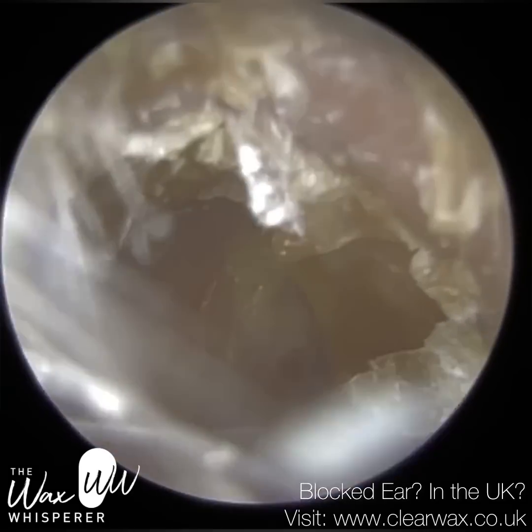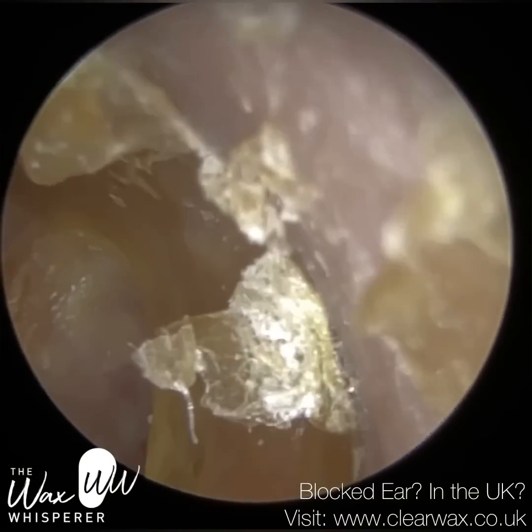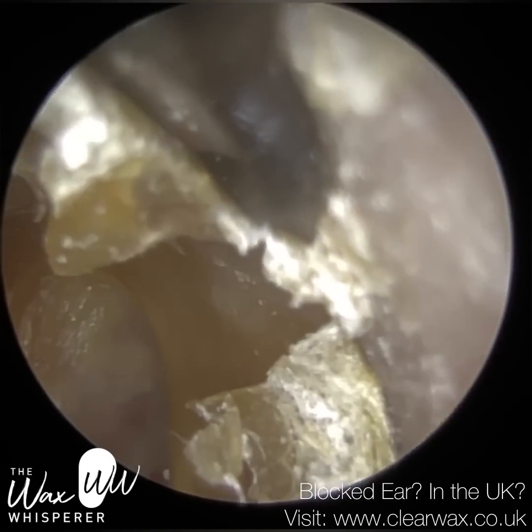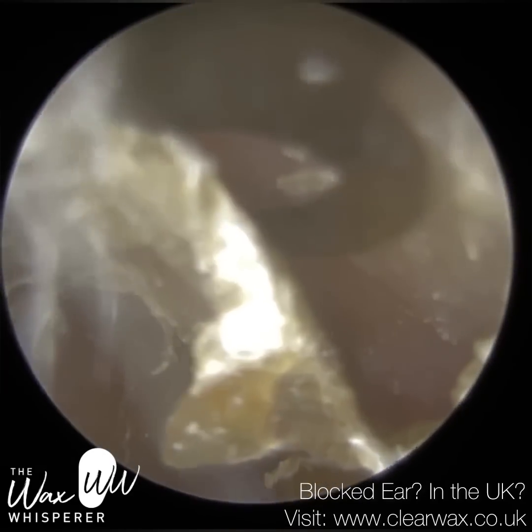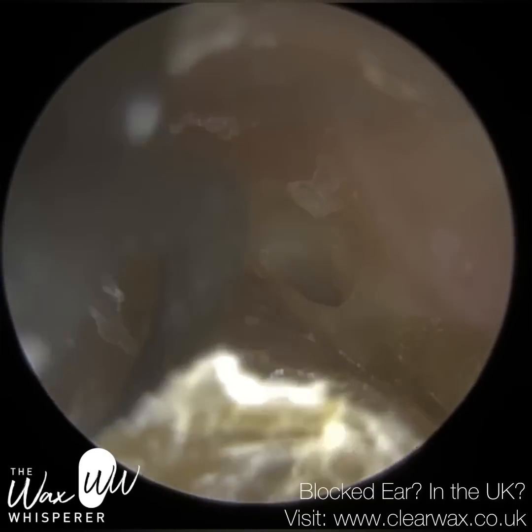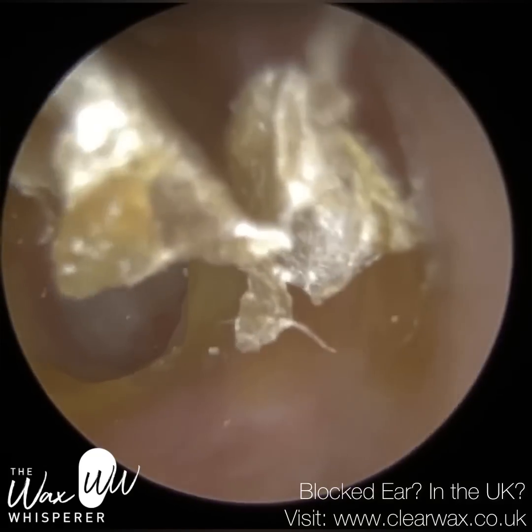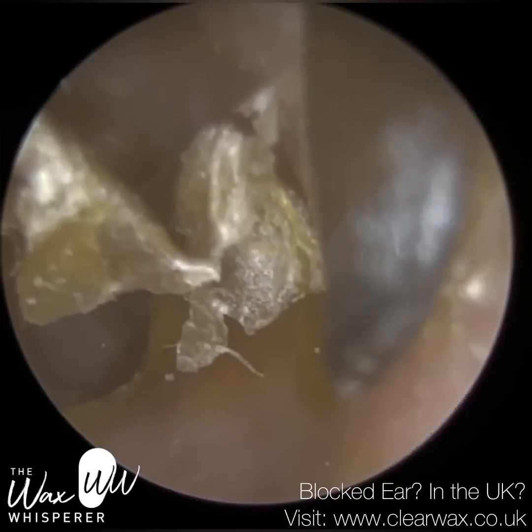Now I've removed most of the discharge off the eardrum, and we are going to get some out afterwards. But here, I'm now going to use the curette to help elevate and retract this crusted layer of skin off the ear canal. This skin has been coated by some of the discharge in the ear, and that discharge has solidified and crystallized this skin. And you can see that we've lifted the entire blanket and thick layer of skin that was sitting on the anterior canal, or the front part.